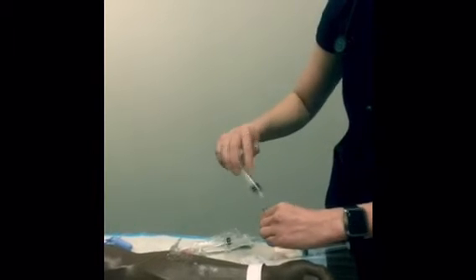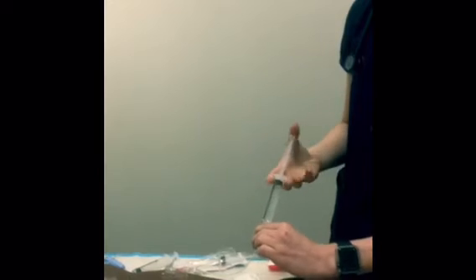Now that we've got that, we've got your medication here. Again, this is your furosemide. 40 milligrams is what we have ordered for you. So we're going to hook that up. And we're going to put this in over 2 minutes, so it's going to feel like a long time. I know that I'm just standing here talking to you. But we want to go in slowly to make sure we don't have any rapid side effects. Just want to assess how the medication is affecting you as we put it in.